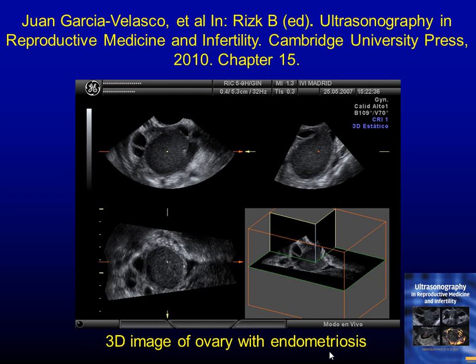Here, what I'm trying to show you is that the endometrioma ate up most of her ovary, left her with 3 follicles. So when you have 3 follicles, you have to counsel the patient on 2 things. Number one, that if you remove those endometriomas, her ovarian reserve, or what we call ability to respond to fertility drugs, will be low. Not because of anything you have done, but because simply this endometrioma over the years ate up the majority. So left her with 1, 2, 3 follicles, maybe 4. So a woman in her prime age who has 3 follicles will not respond. That is just a matter of fact. You do not create what is not there.